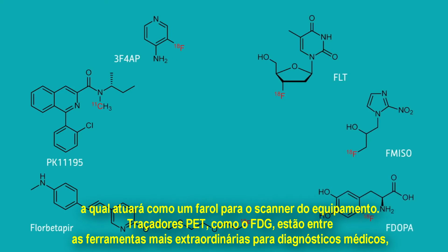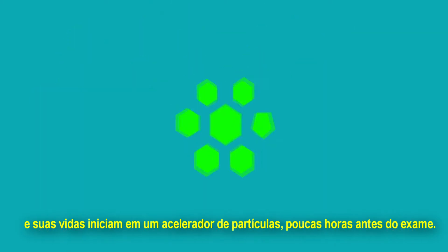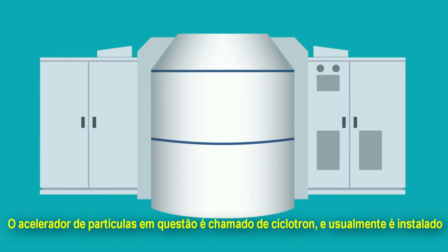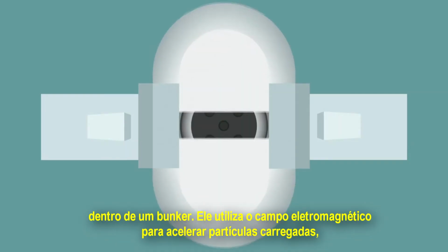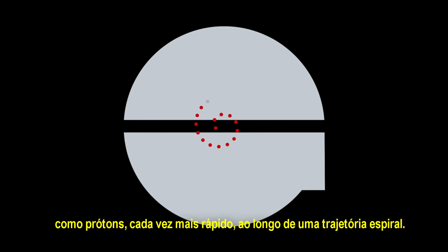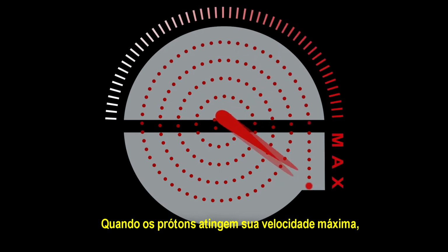PET tracers such as FDG are among the most remarkable tools in medical diagnostics, and their life begins in a particle accelerator just hours earlier. The particle accelerator in question is called a cyclotron, and it's often housed in a bunker within hospitals. It uses electromagnetic fields to propel charged particles like protons faster and faster along a spiraling path. When the protons reach their maximum speed, they shoot out onto a target.